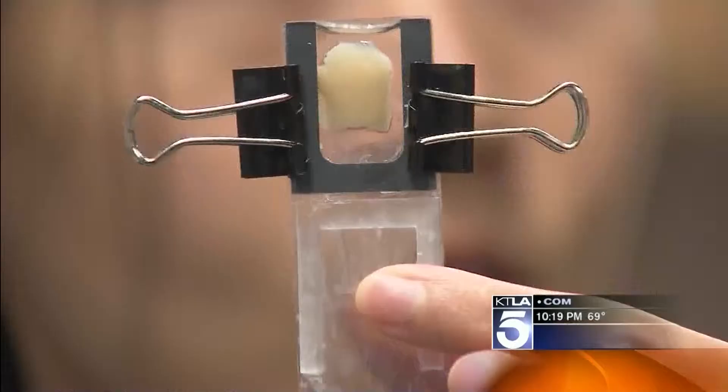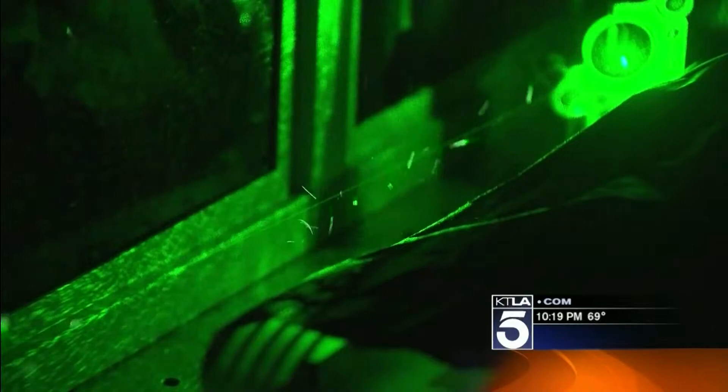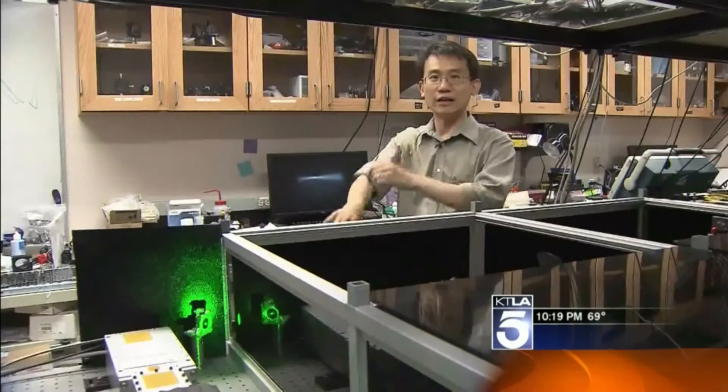I'm Professor Changhui Young. This Caltech professor and his students — this is a piece of chicken tissue — Ying Min-Wayne and Benjamin Judkowitz are working on inventing surgery without cutting. They start with a powerful laser that could easily cut through the skin, and you can basically use that as a laser scalpel.